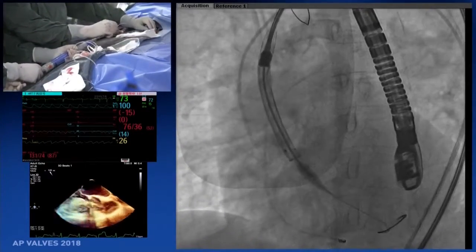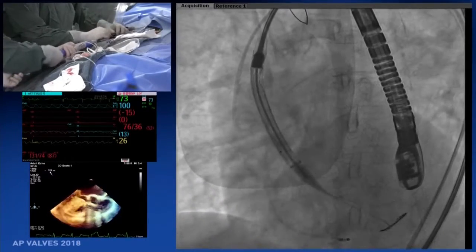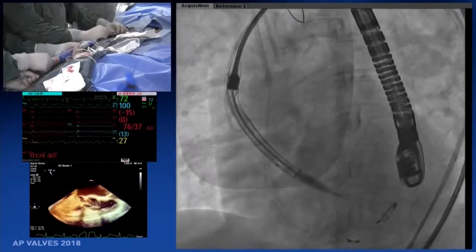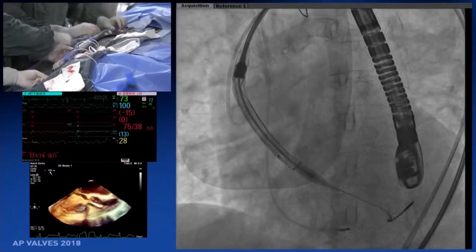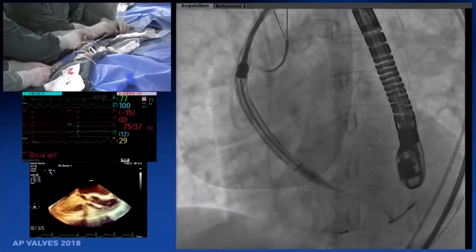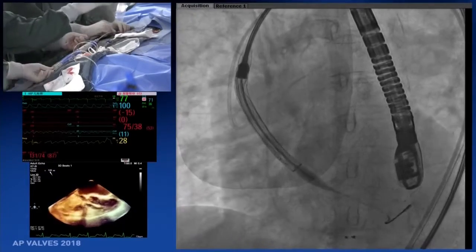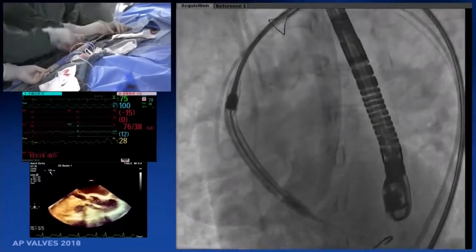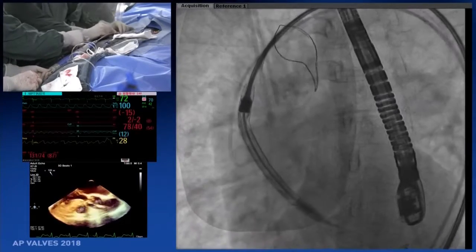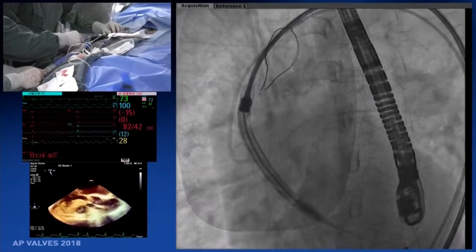It's very low. I mean, this is really... Sorry. Wait a moment, you're recapturing it? Fully recaptured. Okay. Sorry, how many times can you recapture? Push this down again. I never read the IFU. Let me ask the engineer how many times we can lift that. I think officially it's three or four times.